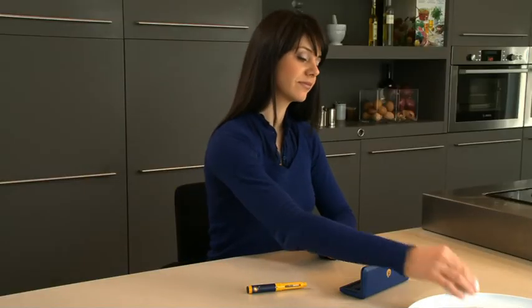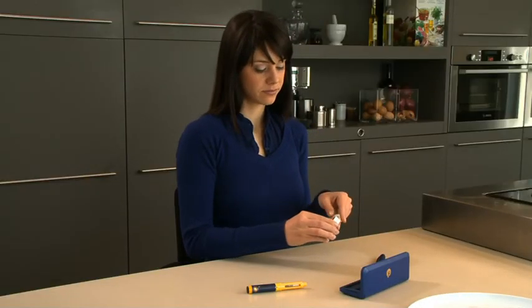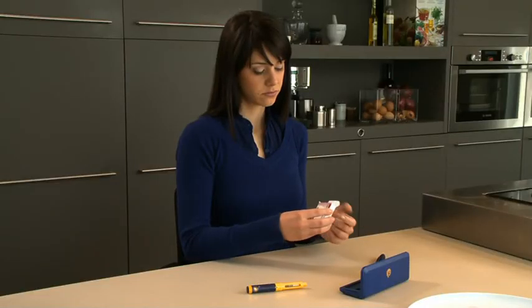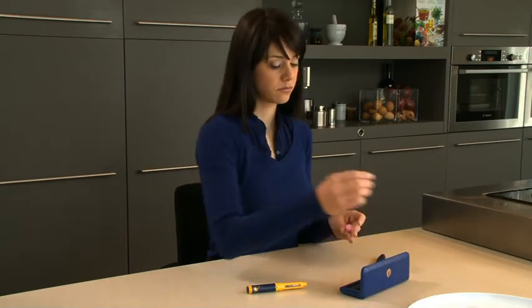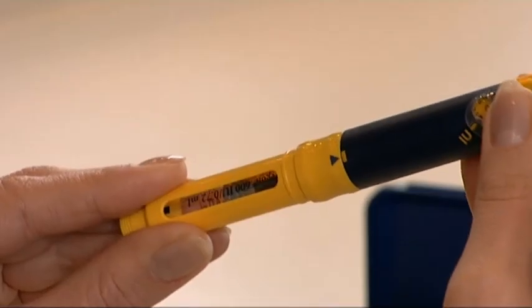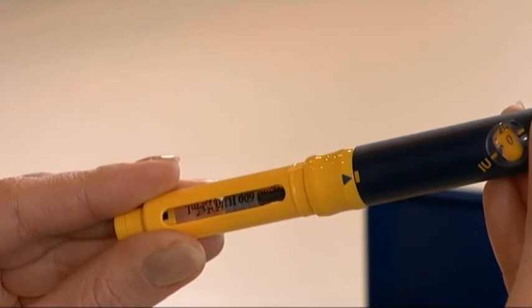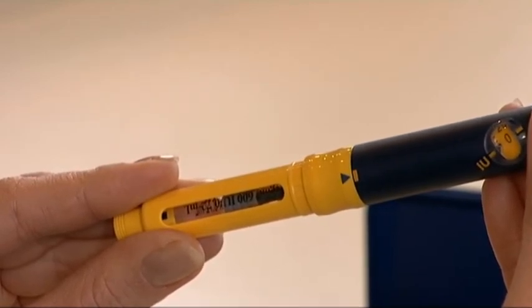The following steps should be performed every time you inject Puragon using your Puragon pen. To reduce the risk of infection, always use a new sterile needle for each injection. Make sure that the cartridge holder has a cartridge in it before you attach the needle — you can see the cartridge through the window of the yellow cartridge holder.